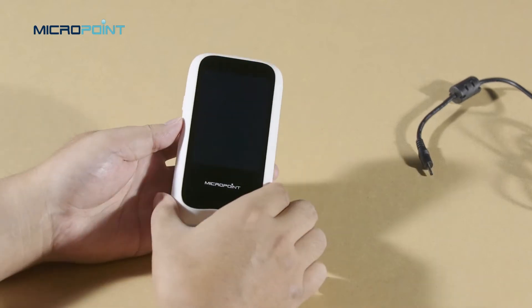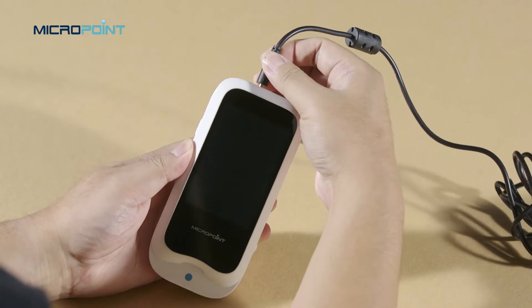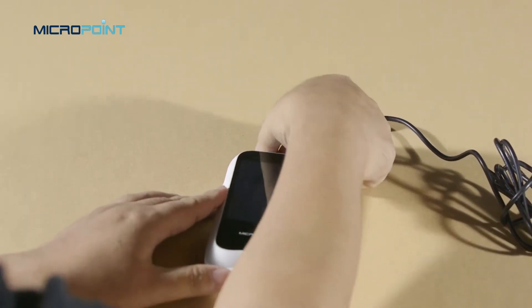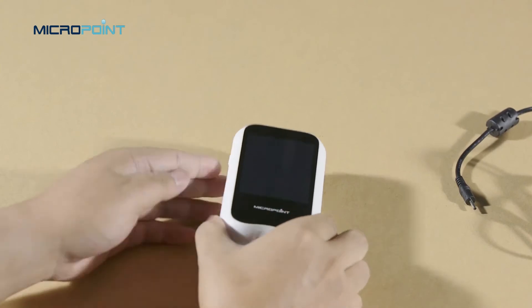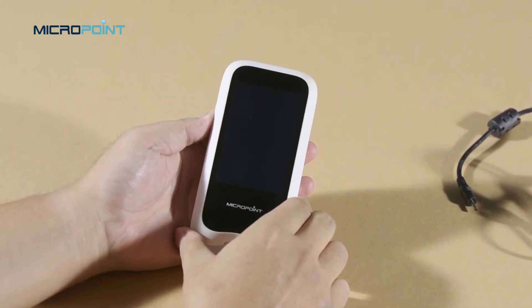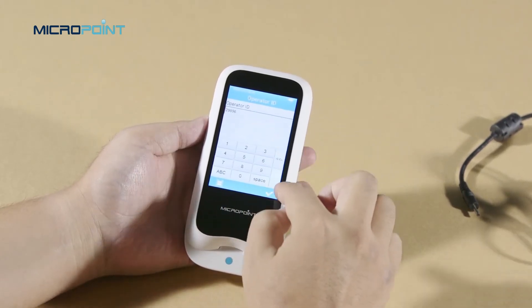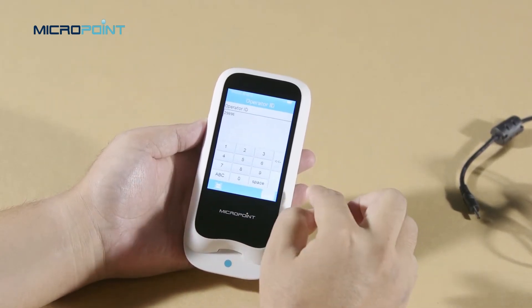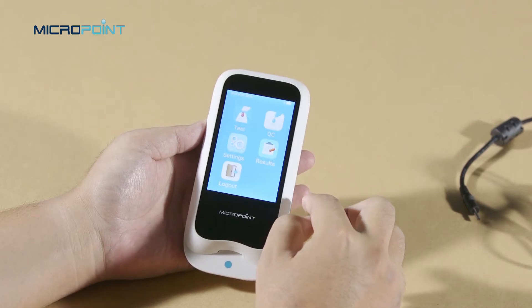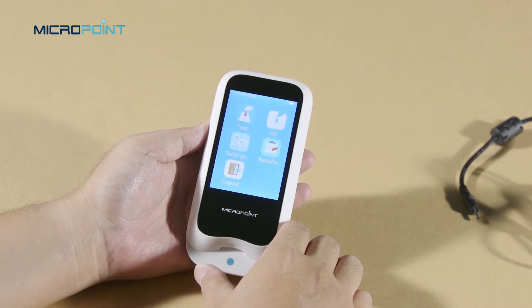When the Q-Labs Meter is initially powered on, the battery must be fully charged. Press the power button for 3 seconds. The meter will beep and enter the main menu screen. If operator ID is set to on, the meter automatically enters the operator ID menu after it is turned on. Press and hold the power button for 1 second to turn it off.